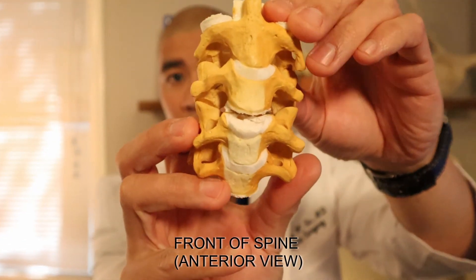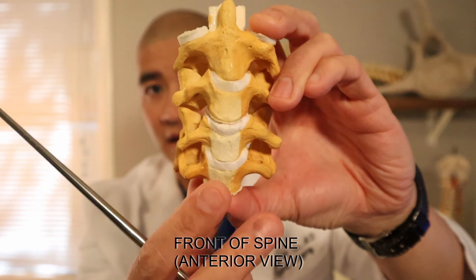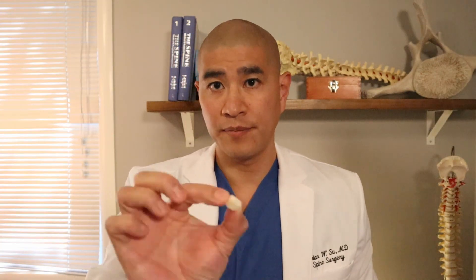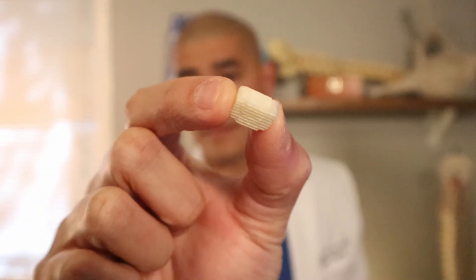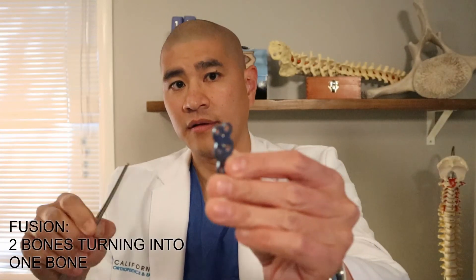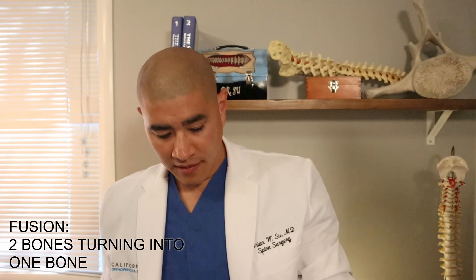The idea of an ACDF is that we take the disc out and take this big bone spur off the nerve to create an opening for the nerve. We take the disc completely out from the front of the neck, and after we take it out there's a space we can't leave alone. So in its place, we put a piece of bone graft or a cage, and then we put a plate with screws through it into the bone, securing it and making it a fusion.